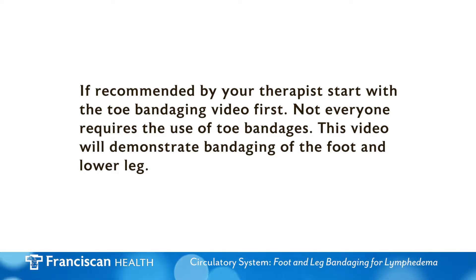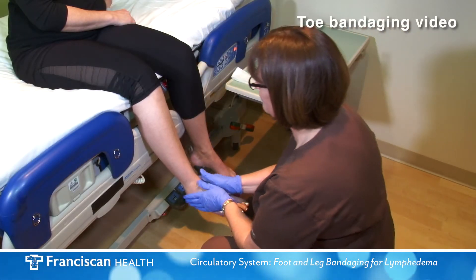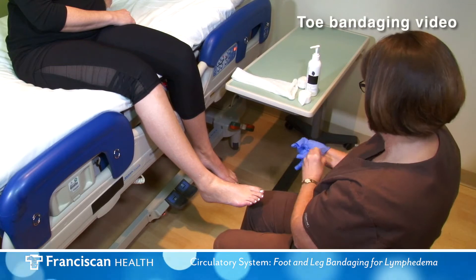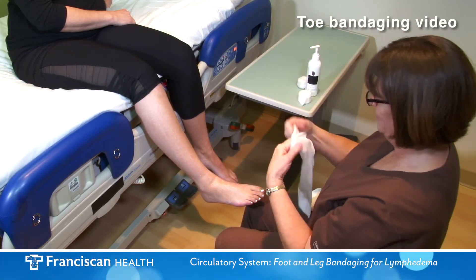After first performing good hygiene to the area, apply low pH lotion, fragrance free and dye free, such as Eucerin or Elta. Apply tubular bandage or stockinette from the base of the toes to the knee, as seen in the toe bandaging video.